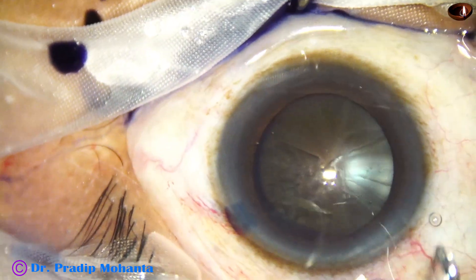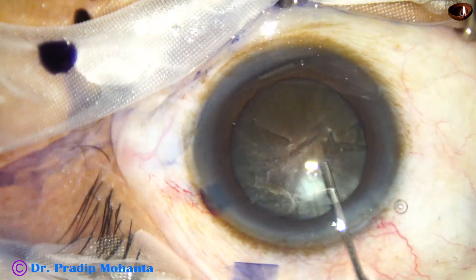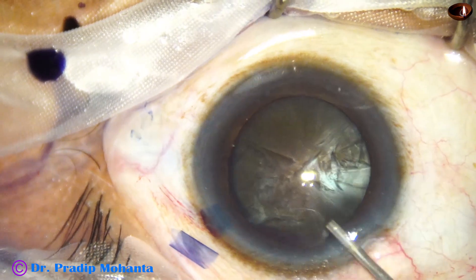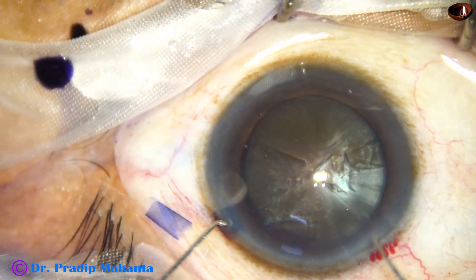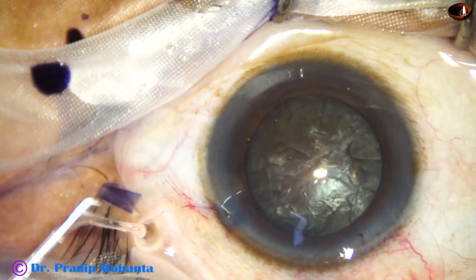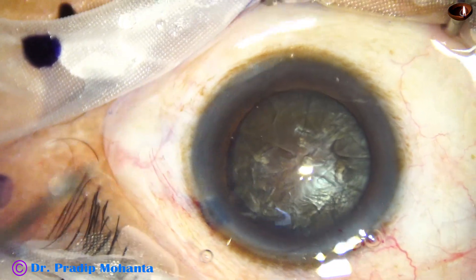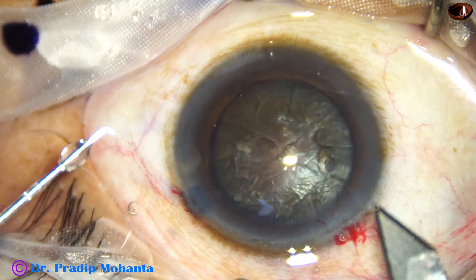Hydrodissection is done at multiple points — small aliquots of BSS are injected and the nucleus is tapped. Some more viscoelastic, and I am going to bimanually rotate this huge nucleus. Again viscoelastic, and now is the time to introduce the FACO handpiece.